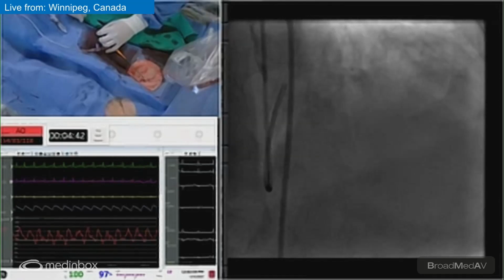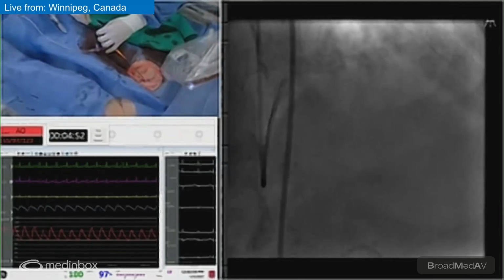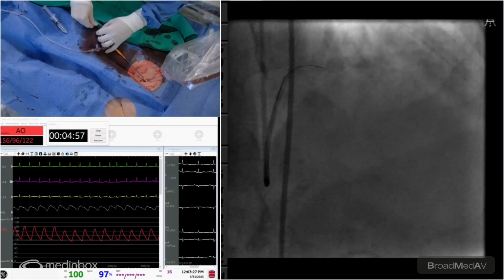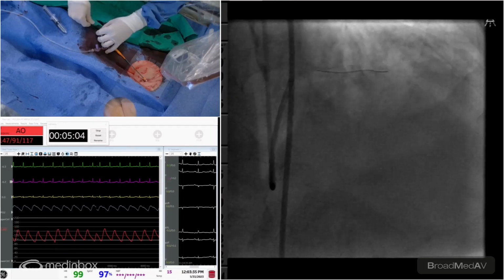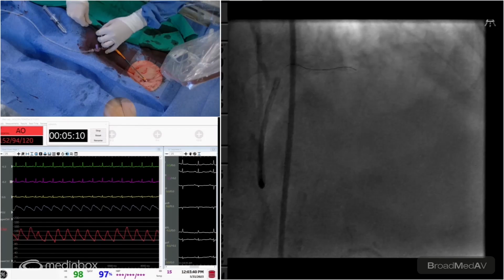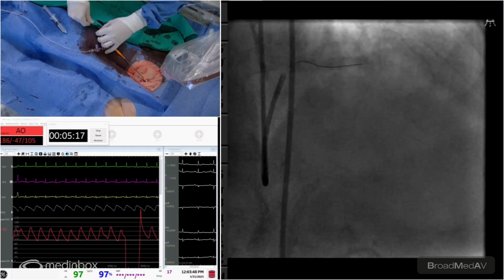So we're going to go with our BMW. Can I get a wet one, please? Perfect. I always feel when you wire, even with a workhorse wire in some of these complex cases, it allows us to... The diagonal there, that guy just wants to go to the diag. Give me a little left there. And there we go.